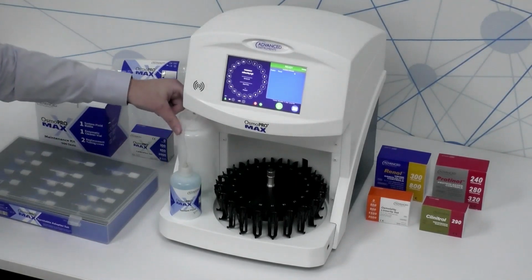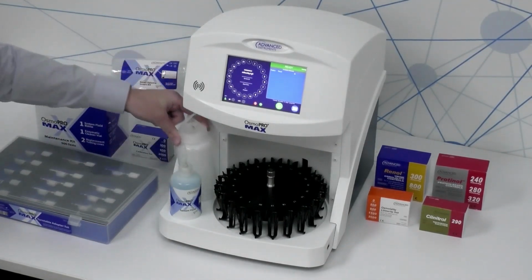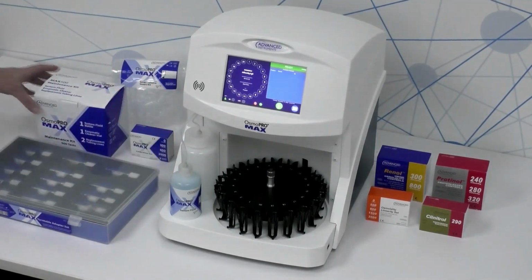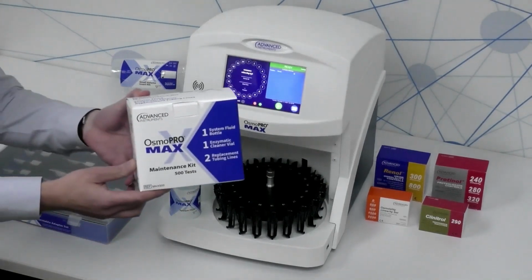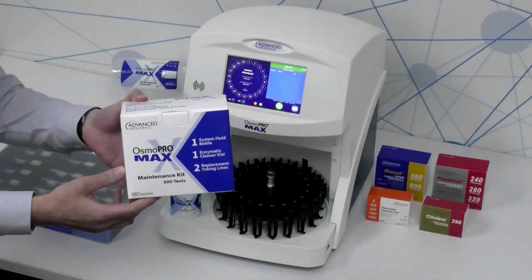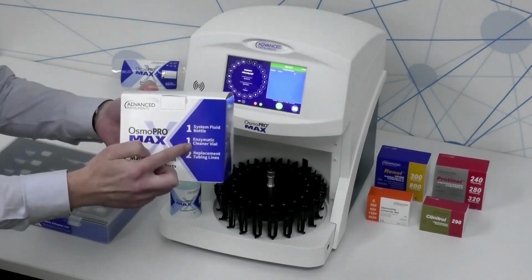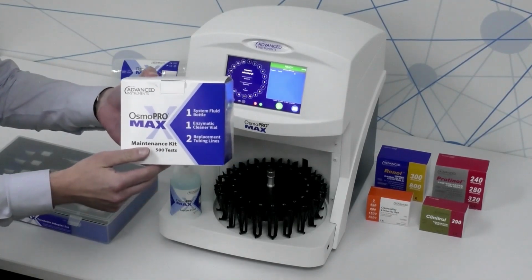A waste bottle then collects used system fluid and tested samples. After testing 500 samples, the items in this maintenance kit would be replaced. The kit contains a bottle of system fluid, a vial of enzymatic cleaner, and two replacement peri-pump tubing lines.